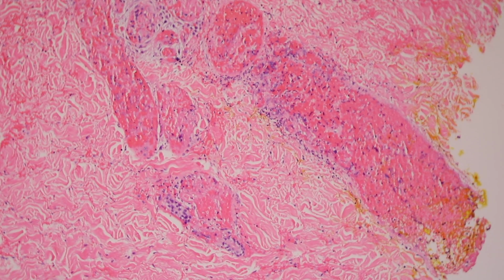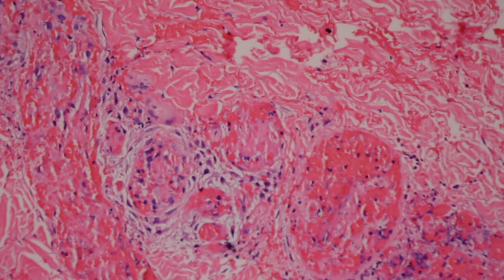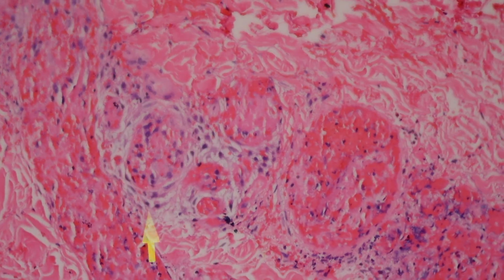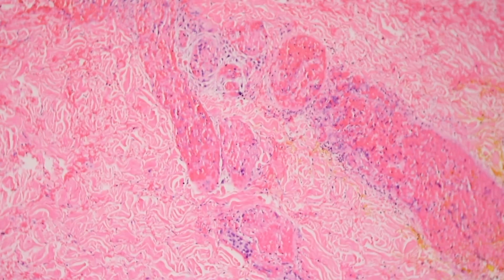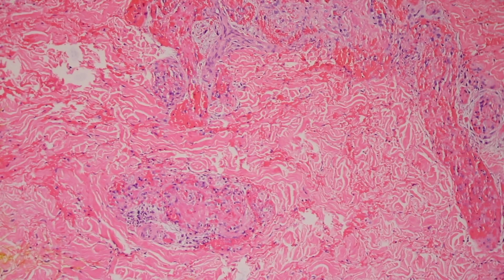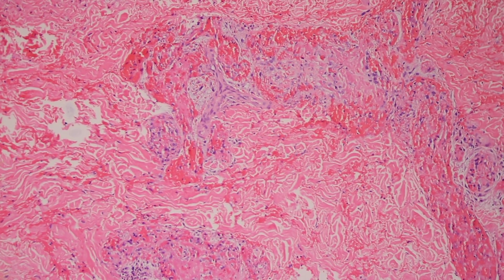Look at these huge dilated vessels, and they're filled not only with blood. The blood's the bright pink stuff, but look at the pale pink smudgy stuff. That's fibrin, right? So we have fibrin not only around the outside wall, but it's filling up most of these vessel lumens. Tons of fibrin. This vessel right here is almost totally filled. So the vessels are basically filled with clots. All of these are fibrin thrombi, or what we, the lay people, would refer to as clotting.